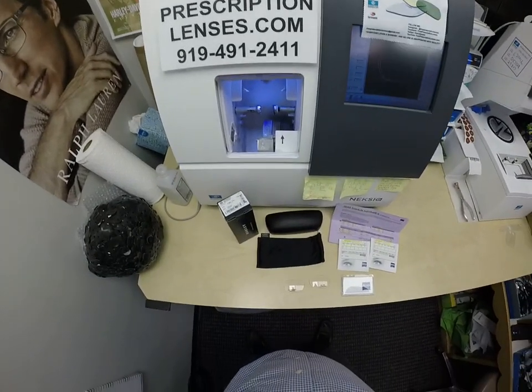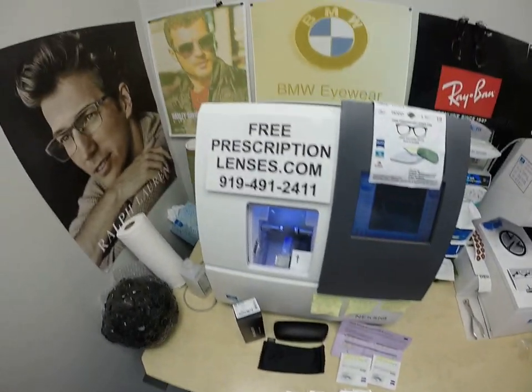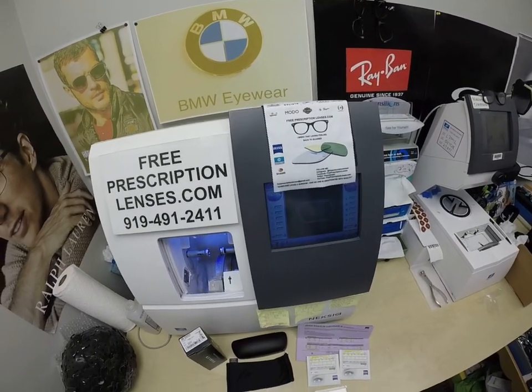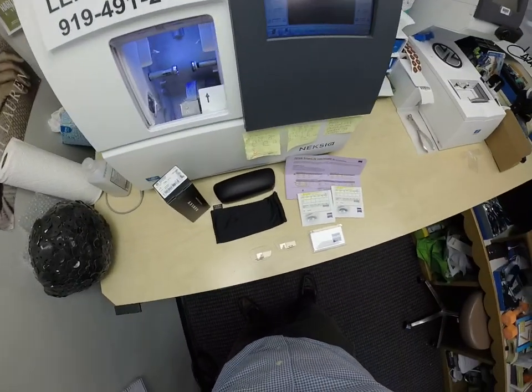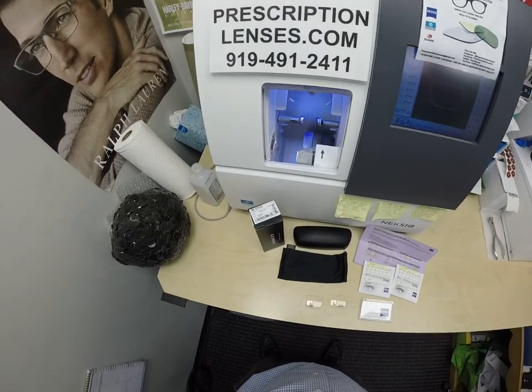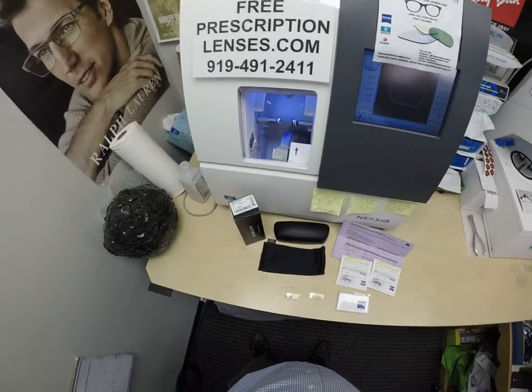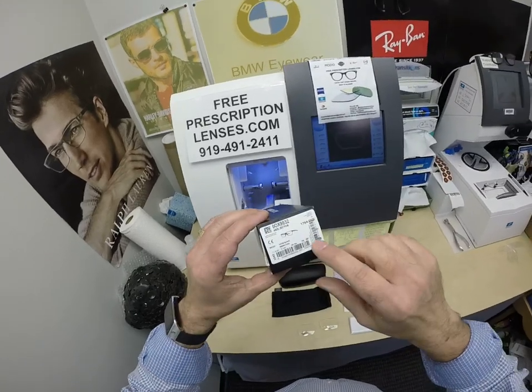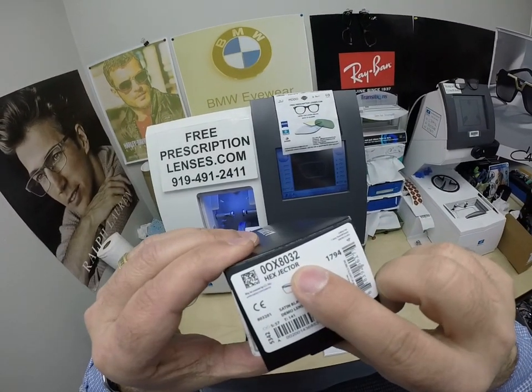Hello everyone, a special thank you to Daniel in Woodbury, Minnesota. This is freeprescriptionlenses.com, where everyone loves a bargain and no one is disappointed with quality. I am the hardest working optician in the industry. My name is Seymour Better, but call me Moe — Moe Better — because I may have you seeing Moe Better, looking Moe Better, and I'll show everyone how to bring that loving feeling back to glasses when I show you Daniel's Oakley 8032.